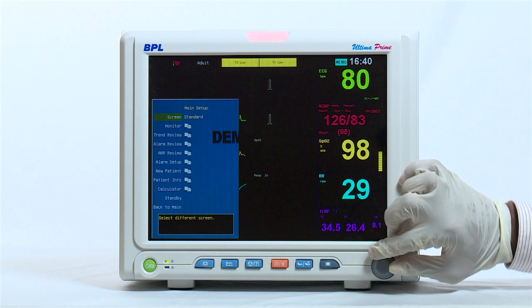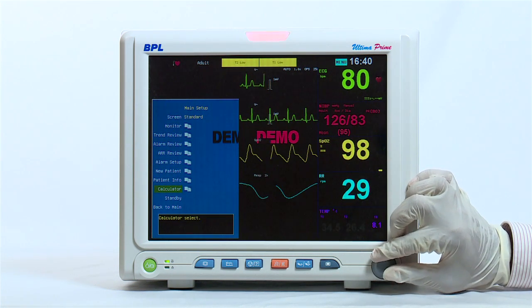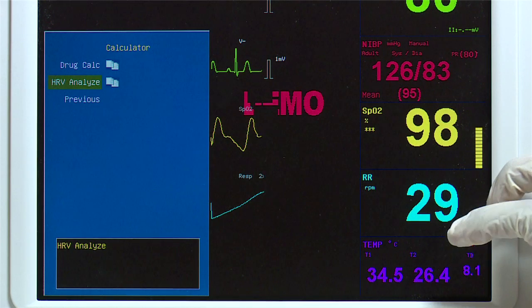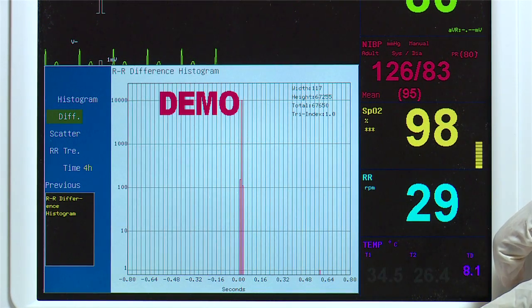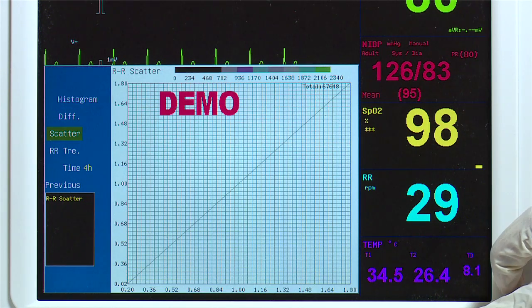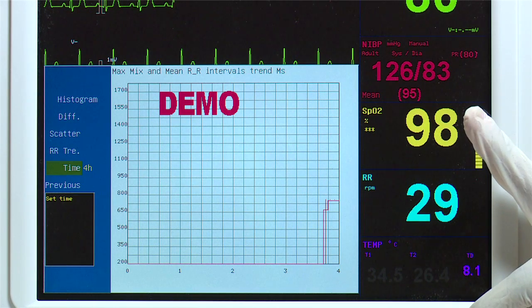A calculator function is available with heart rate variability analysis, indicating the beat-to-beat alterations in the heart rate. This function includes statistical analysis to help analyze beat-to-beat functioning of the heart, such as the RR histogram and RR scatter analysis.